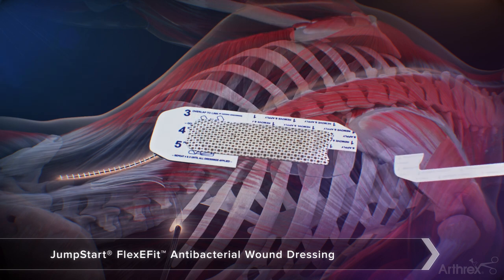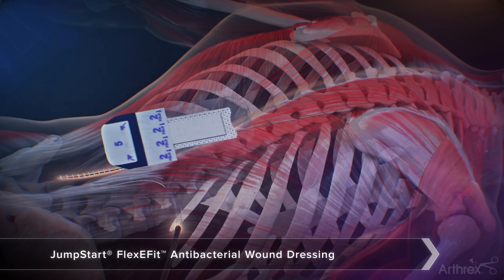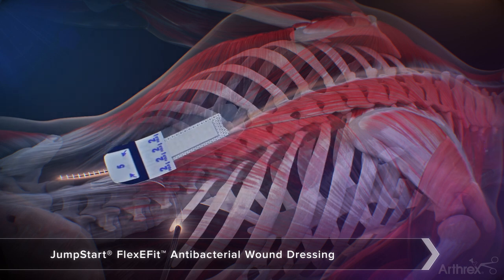Remove the liners labeled 1 and place on top of the proximal portion of the incision. Make sure to press down gently on the dressing to ensure direct contact of the pad with the incision.